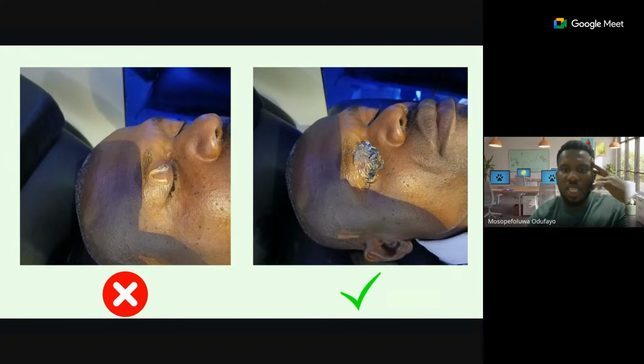However, when the gel is used this way, you put your probe just on the gel, and then you have an interface. You don't even need to put pressure at all, just a touch of your probe on it. And then you are able to see all of the structures very, very clearly. So please, copious amount of gel. Don't spare, but at the same time, don't waste.